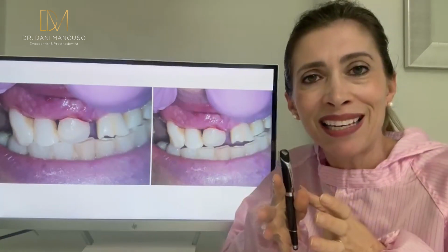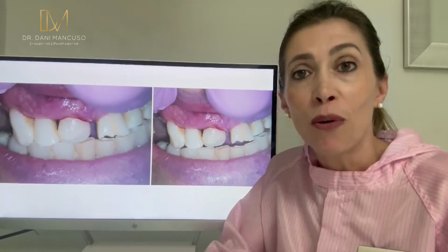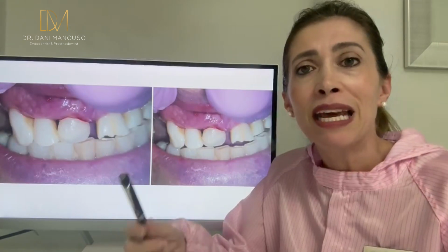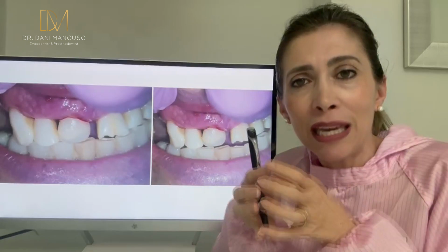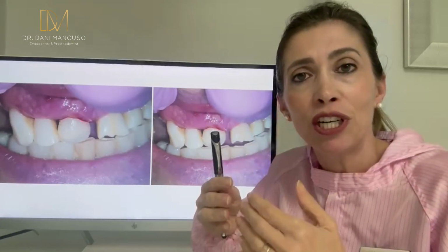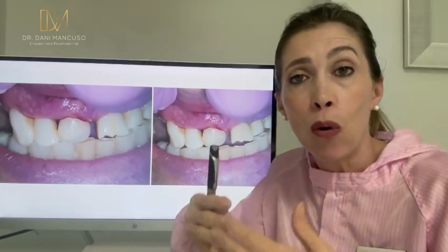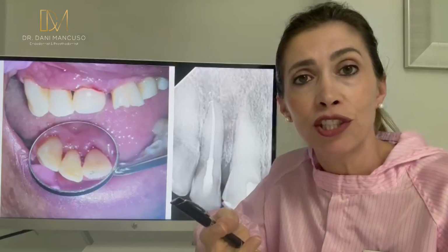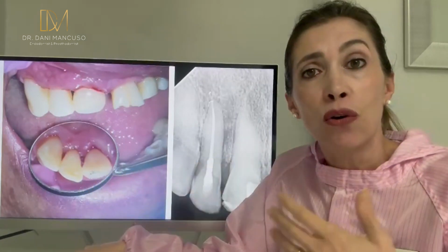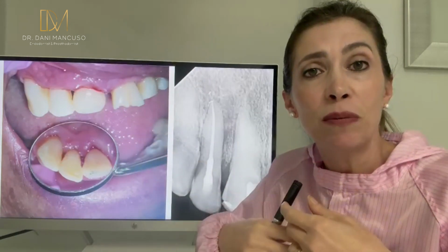You want to balance that, because what you don't want is too much pressure on your lateral, because you've just finished the root canal treatment. That tooth was with mobility grade 2. You want that tooth to heal. And if you have pressure, if you have premature contact, that will delay the healing and may compromise it. Balance the occlusion, protrusion, and lateral excursions so you can protect your treatment. And this is it. It's the final treatment for you.